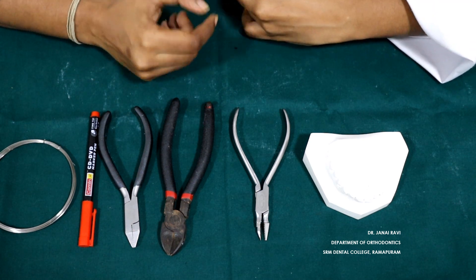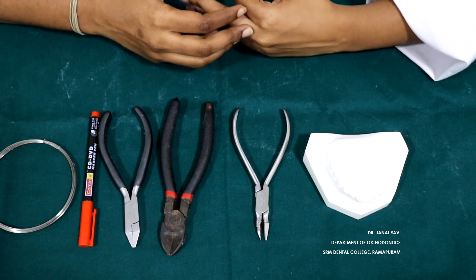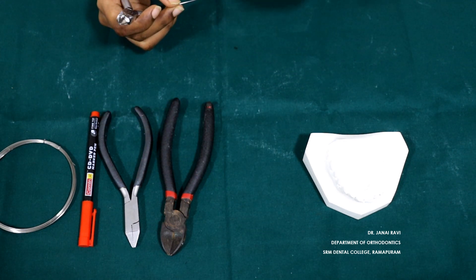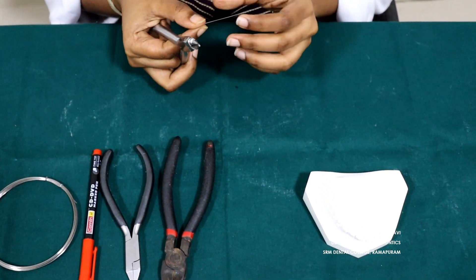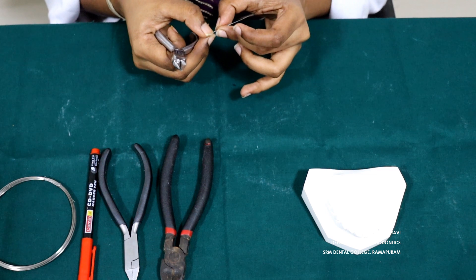Single cantilever springs are generally used in correction of anterior crossbites where a single tooth is palatally displaced — we can use these springs to push it more labially. Cantilever springs are called cantilevers because they are supported at one end. This will be supported by the appliance at one end and the other end will have an active arm which will push the tooth on the outer surface.